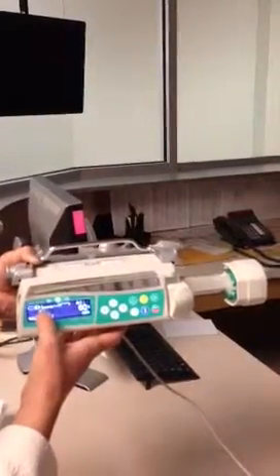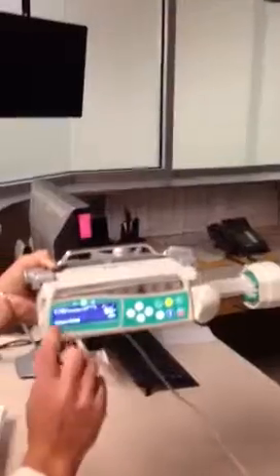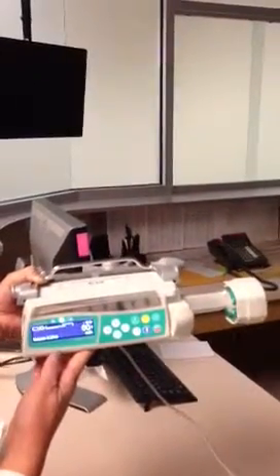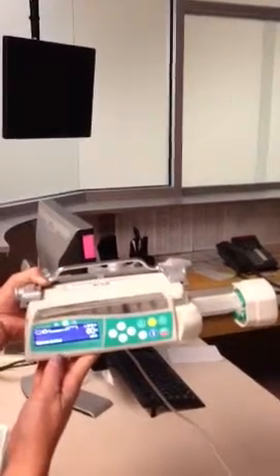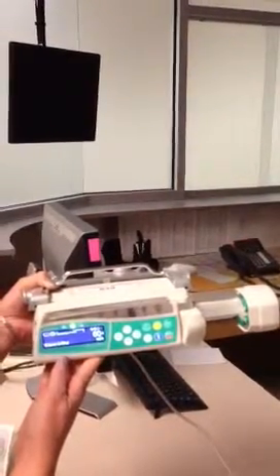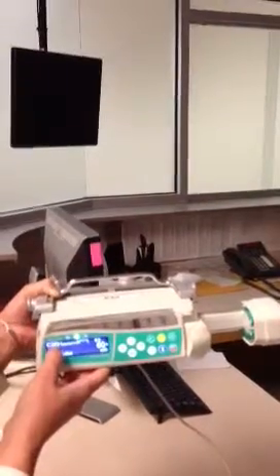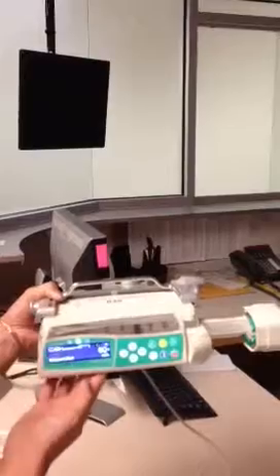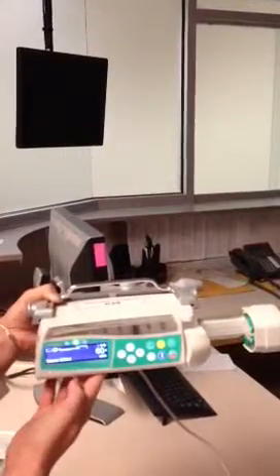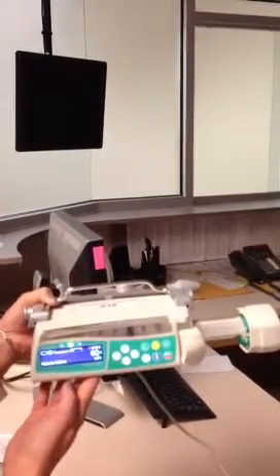If you started to see an occlusion or any sort of buildup in your line, you'd see a white bar come across the screen and the pump would tell you that it has occluded — you'd need to figure out where there's pressure in the line. You'll also see a little plug icon indicating that we're plugged into the wall, and then you'll see your battery life in thirds. Our battery is fully depleted on this pump right now.